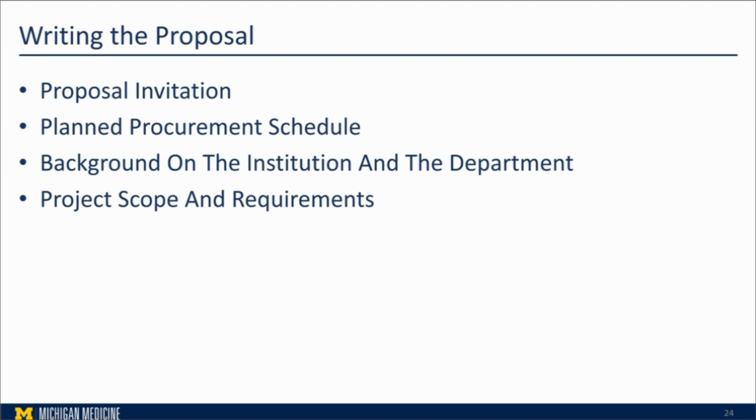Some of them, once we give them this background and the requirements of the scope, drop out. They say, no, this is not for us. Maybe they are not intended to leverage this amount of scanning or this advanced way, or maybe they built their platform only for research and education, and they don't have a platform for primary diagnosis.